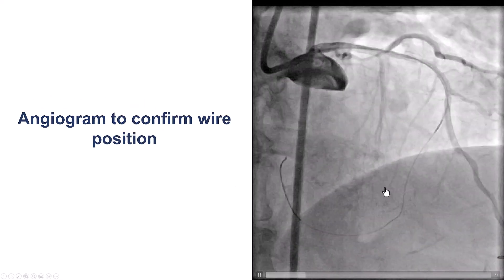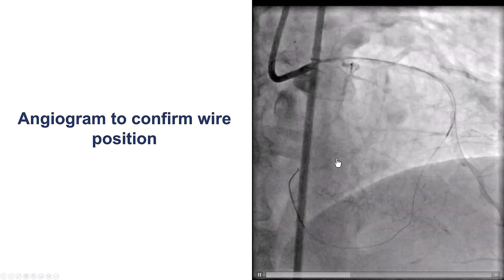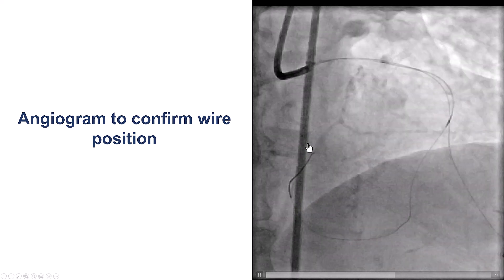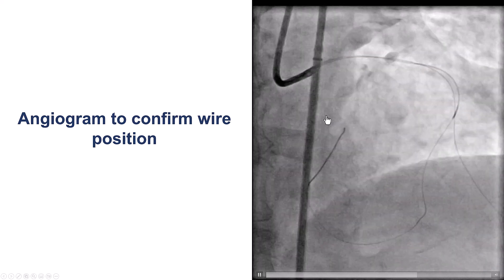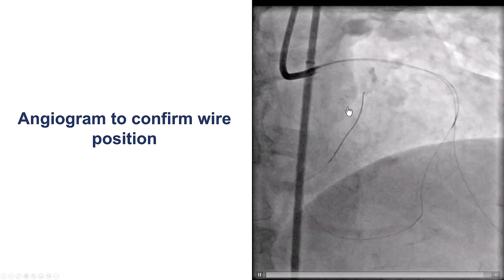Of course, we had to confirm that. This is the confirmation, showing that the retrograde wire has actually entered into the distal true lumen.